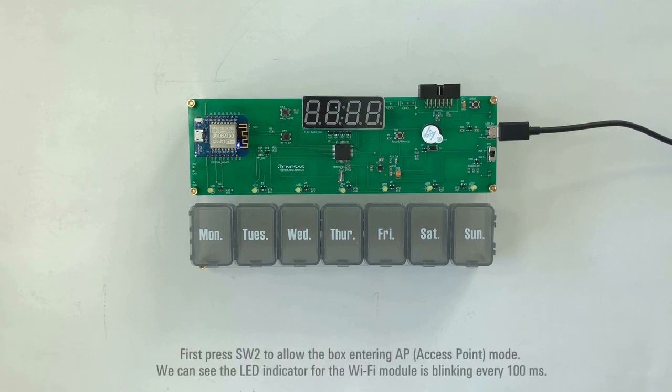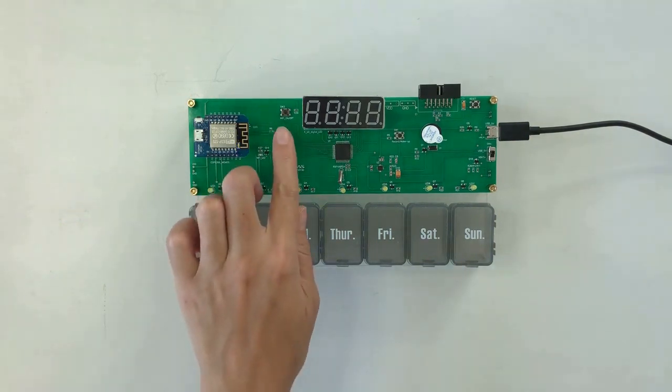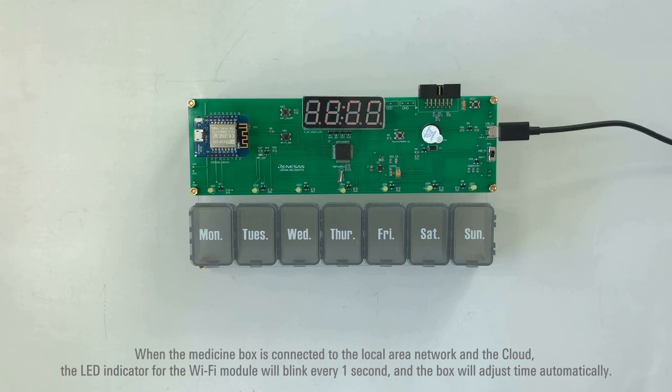First, press SW2 to allow the box to enter AP mode. We can see the LED indicator for the Wi-Fi module is blinking every 100 milliseconds. Open the app to set Wi-Fi ID and password to add the Smart Medicine Box to the smartphone. When the medicine box is connected to the local area network and the cloud, the LED indicator for the Wi-Fi module will blink every 1 second, and the box will adjust time automatically.